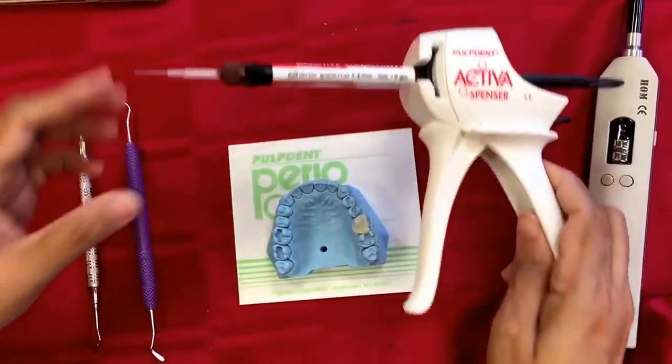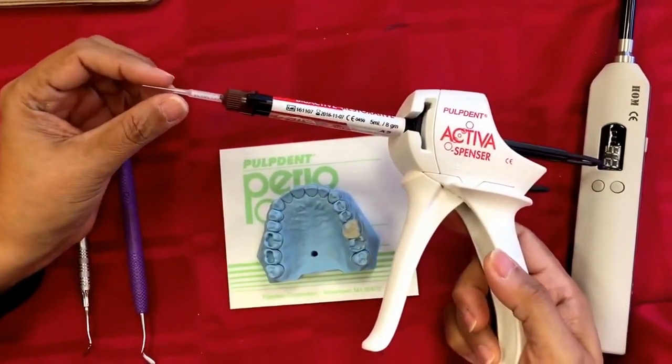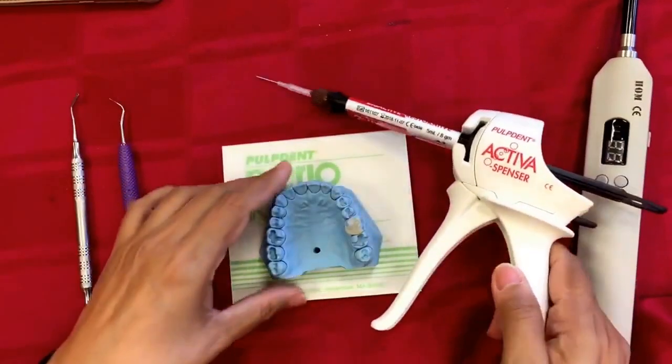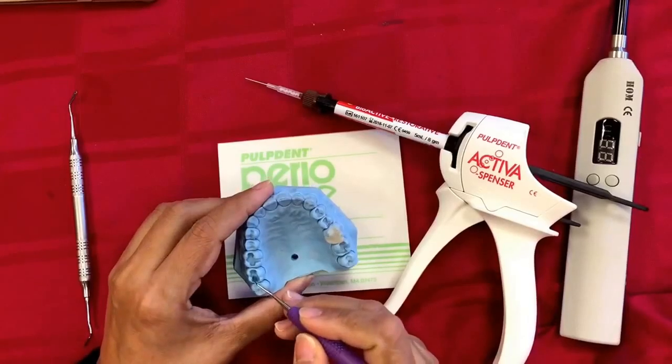Hi y'all, let me show you how easy it is to use the Activa bioactive restorative clinically — it takes less than six minutes. This is the tooth we are working on; the prep has been done with no sharp angles and lines anywhere.